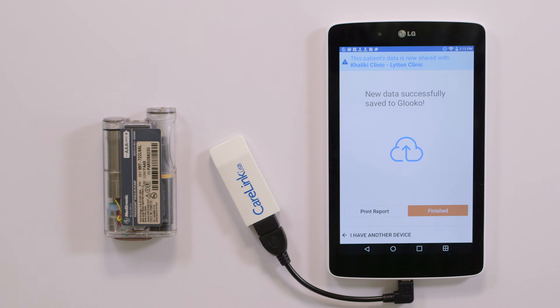Perfect! You've learned how to sync a returning Glooko Kiosk patient who has a Medtronic pump. Happy syncing!